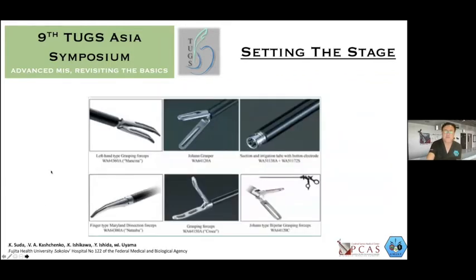So, different types of instruments. You would need different types of instruments for different procedures. But then again, because of the skills and the experience that we have gained through the years of doing laparoscopic surgery, you tend to favor some instruments. And these are the instruments that we would normally make use of during the course of other surgeries.